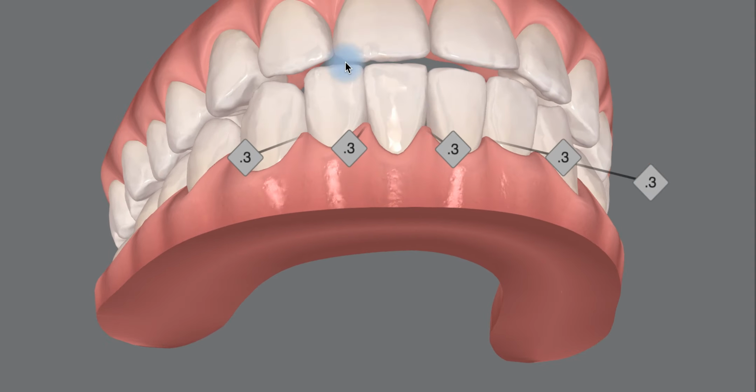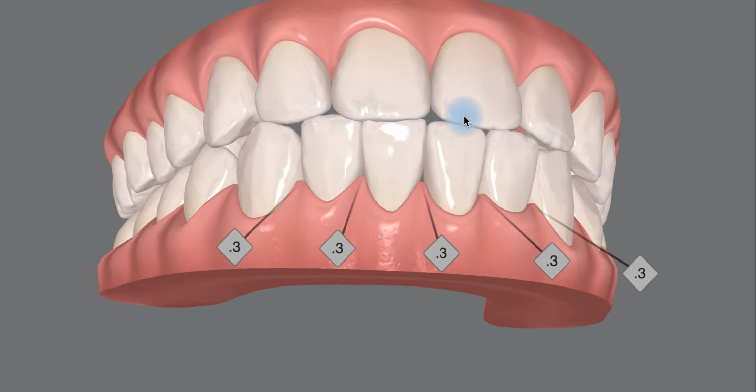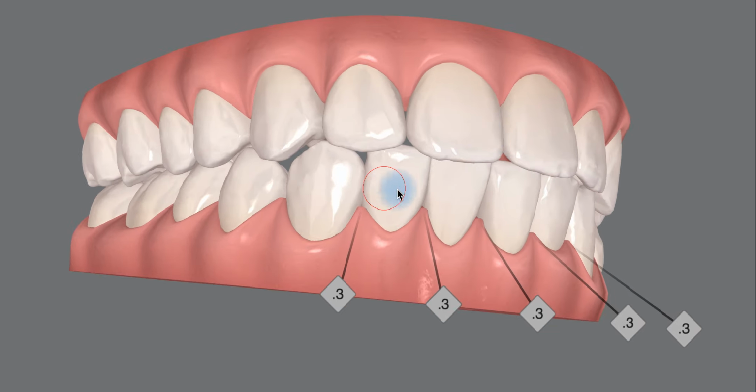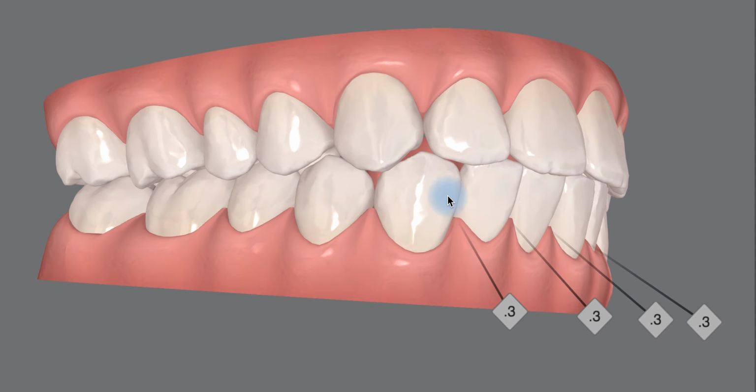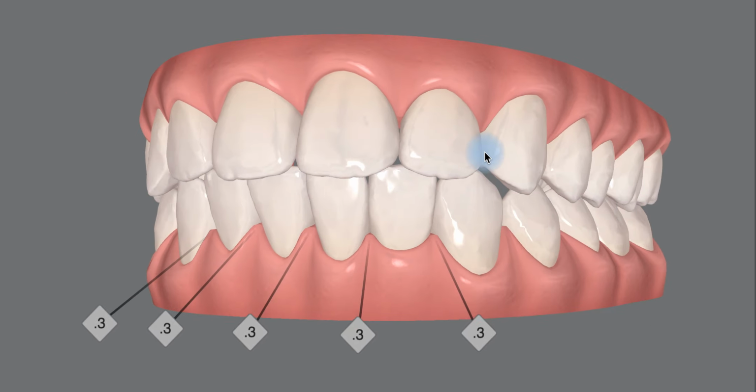I would build in excess overjet here. We very rarely see this amount of overjet when we do this kind of motion. Better problem to have if we have a little bit of it, than to have the opposite problem, which is the anterior teeth end up coupling ahead of time, and we have an anterior interference and a commensurate posterior open bite, which is one of the more frustrating aspects of orthodontics, specifically with clear aligners.